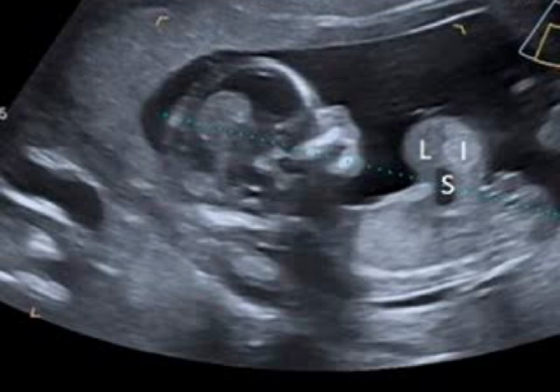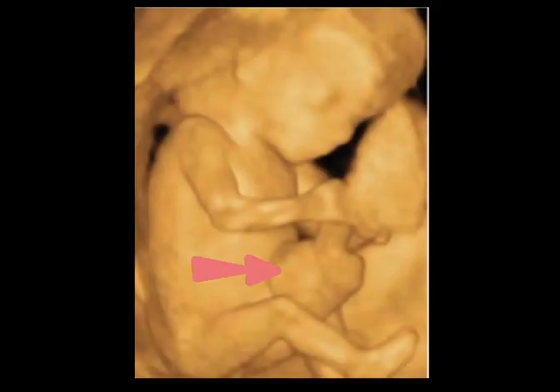Let's get into it. Here's a real case. A 13-week pregnant woman came in for a routine first trimester scan. On the midline sagittal view of the fetus, we noticed something unusual, a herniation at the base of the umbilical cord insertion. We paused to ask, is this normal physiological herniation or are we dealing with a pathological defect? By 12 weeks, the physiological midgut herniation should have resolved, so persistence at 13 weeks raises concern for omphalocele.